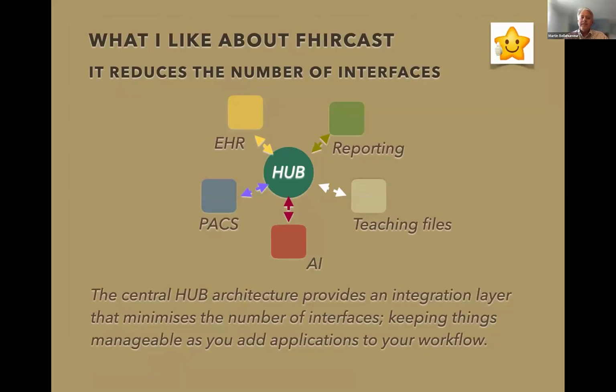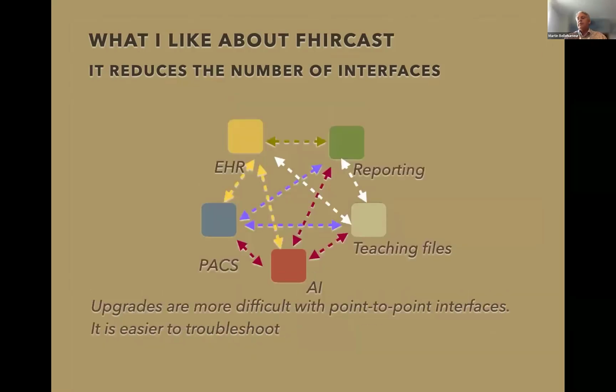It reduces the number of interfaces. Each application only needs to interface with the hub, and using standardized events, it should be much more plug and play than all the customization we've been doing, because we've been doing file drops, we've been calling executables with command line options, we've been calling URLs, and recently a lot of people are doing post messages between browsers after a SMART launch. And all that is customization, and all that is point-to-point between the applications. So if you're a PACS admin trying to troubleshoot a call from the radiologist saying, oh, my PACS viewer closed at the wrong moment, and you want to debug what's going on, you basically have to go in the log files of each of these applications and hope that they have good timestamps in their logs that can help you figure out what's going on.